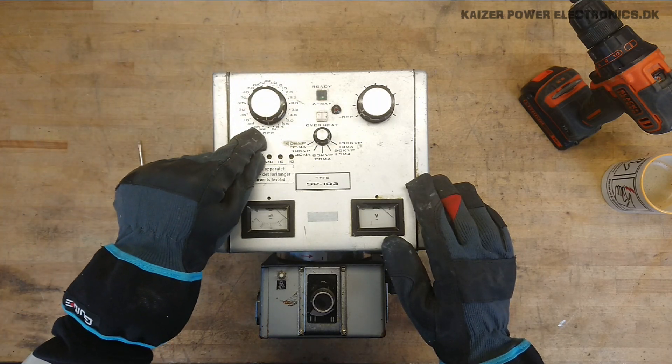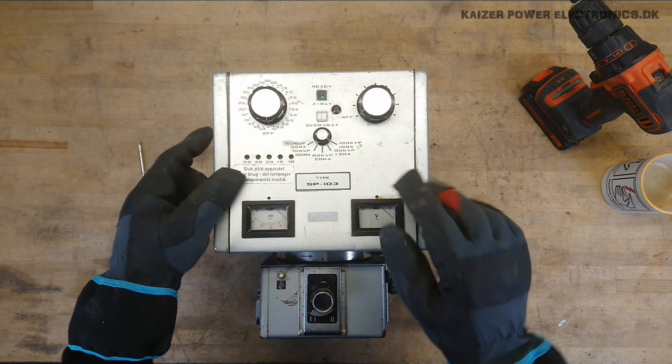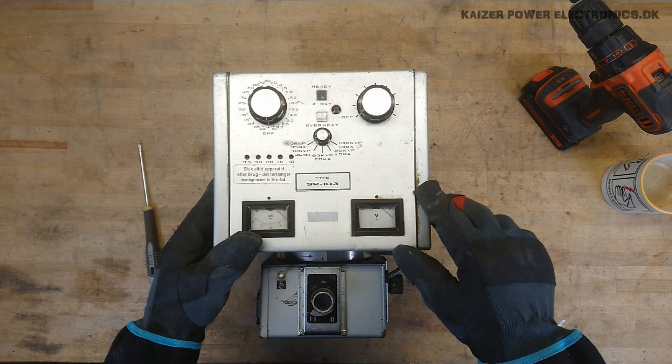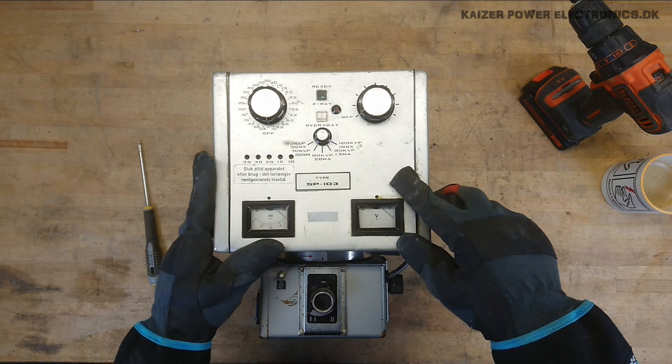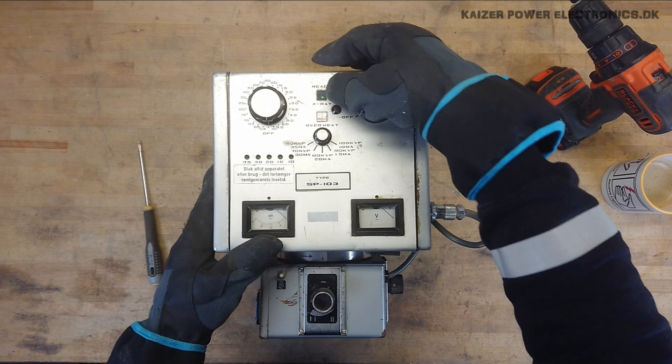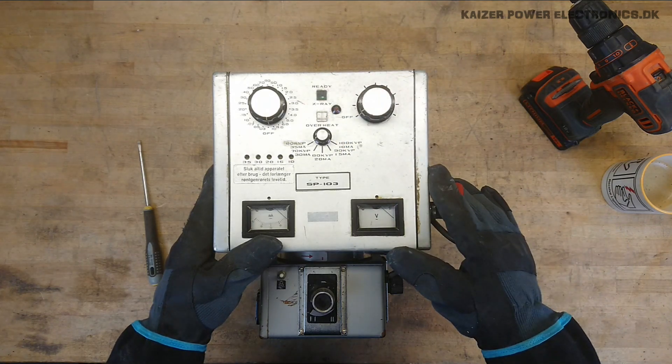Exposure time is 0.3 to 10 seconds. And we have a voltage and current selector switch here, depending on how hard X-Ray radiation you need. We have a ready status lamp.